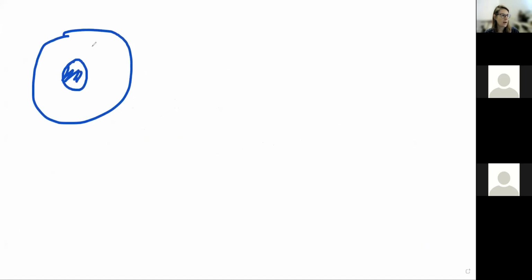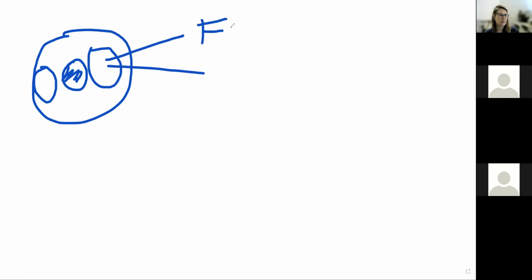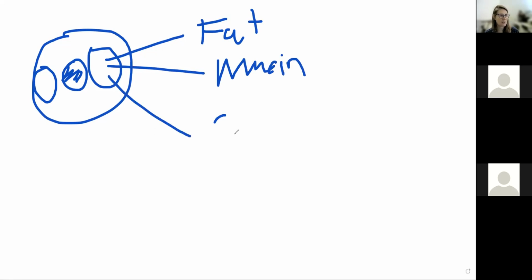Okay. Cool. So you have a cell with a nucleus, and you have some white spaces on the side of the nucleus. I'm just going to do this very casually. And so what are our options for what's in there? We already mentioned a few. We mentioned fat. We mentioned mucin, which tends to have a little bit of a bluish color, but not always. We mentioned glycogen. What other intracytoplasmic things can we see that we might want to evaluate with PAS?